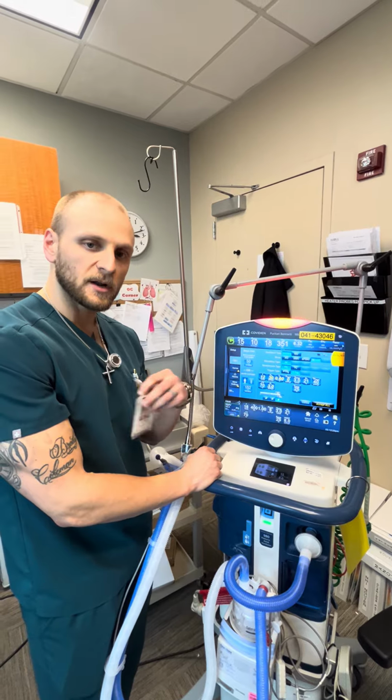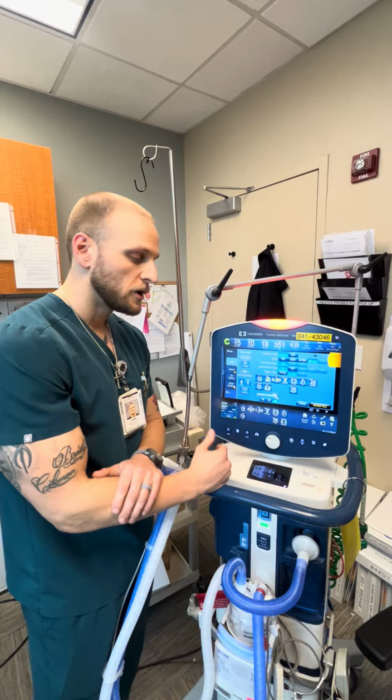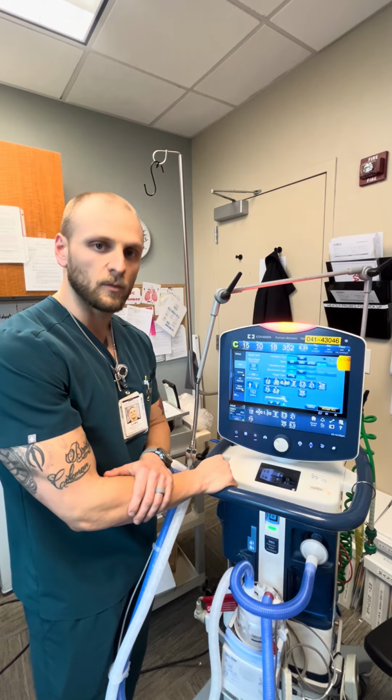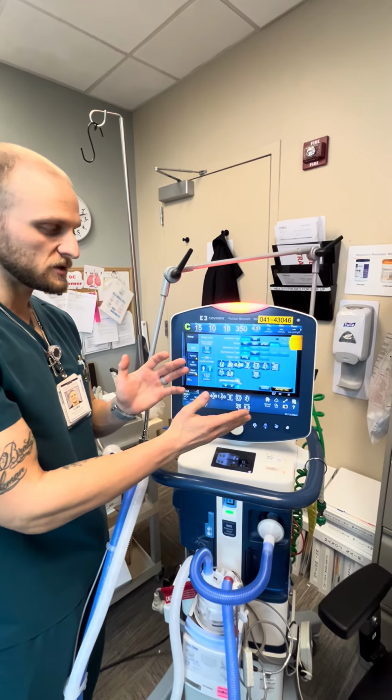On your badge buddy, it does say to raise the sensitivity between 5 and 10. You absolutely can do that. It is not wrong if you do that, but it is unnecessary and you don't need to do that if you don't want to. Okay? So we have our patient ready to go. These are our initial settings.